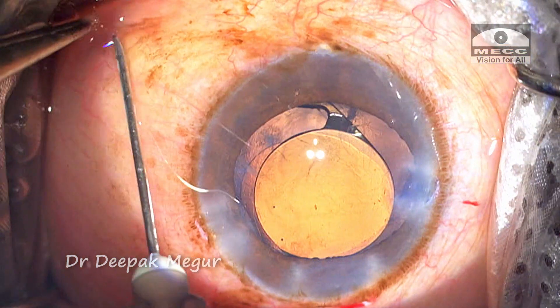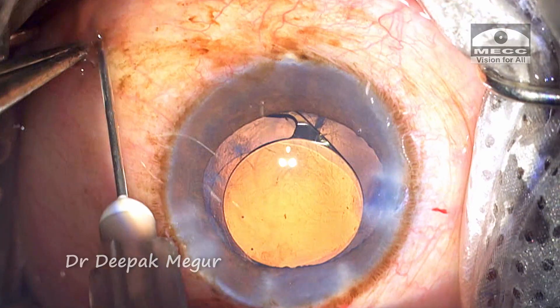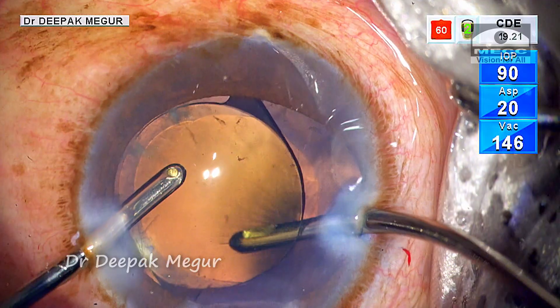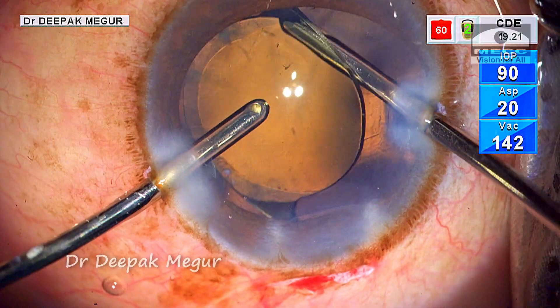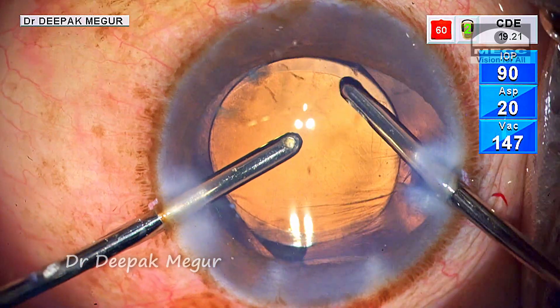I use diluted triamcinolone acetonide to confirm the absence of any vitreous prolapse. At this point the patient is uncomfortable and complaining of pain, so I inject 0.5 ml of lignocaine subconjunctivally to make him more comfortable. The remaining OVD is subsequently removed.